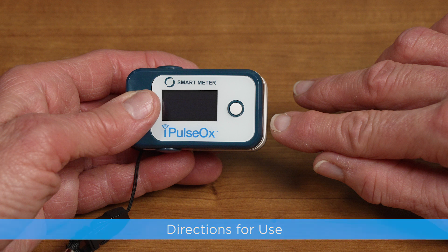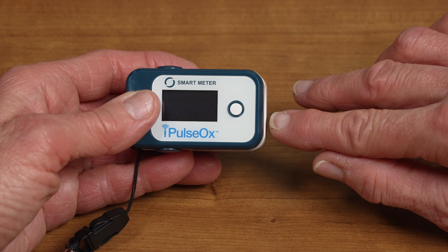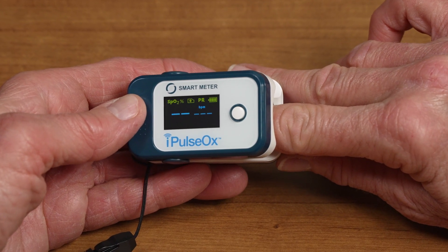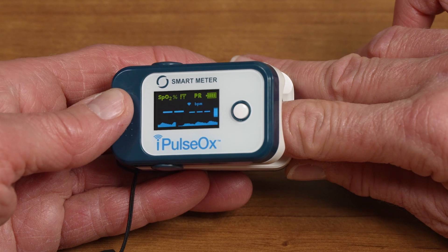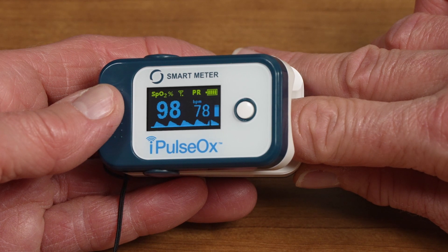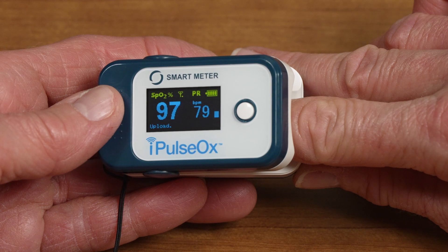Directions for Use. Insert your finger into the device, positioning it between the rubber cushions of the lid. Press the white Power Function button to turn the device on. After a few seconds, the SpO2 and pulse rate values will appear on the display screen. Keep your finger still during the measurement process, which should take approximately 30 seconds.